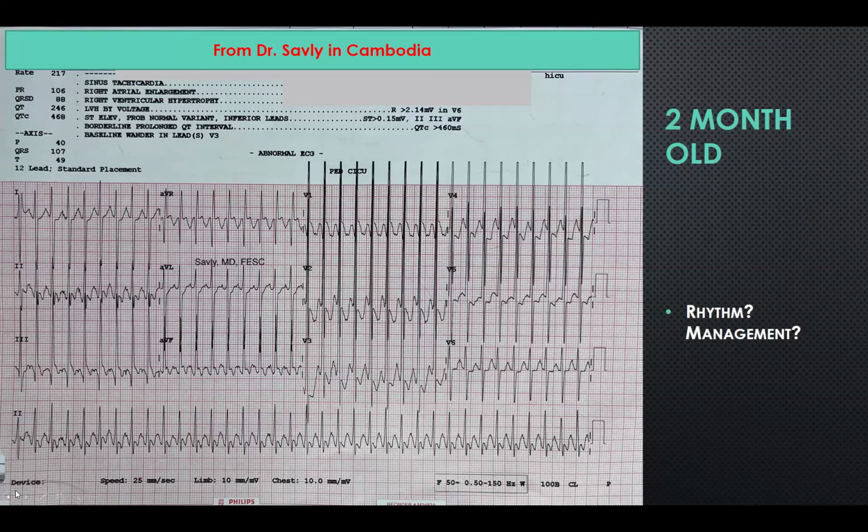Yeah, basically, the main reason is there's no benefit really. I guess the one benefit would be if it could synchronize to the QRSs, then you could be reasonably sure that it's not going to put another shock on a T wave. But the problem is that in VF, the ventricular signal, or I should say the R wave, because it's really just reading off the electrocardiogram, is so variable. In VF, you can have very fine VF with little signals or big signals. So what can happen is if you have it set at synchronize, it's not going to deliver the shock until the device feels that it can confidently sense the electrocardiogram and then properly put the shock in.